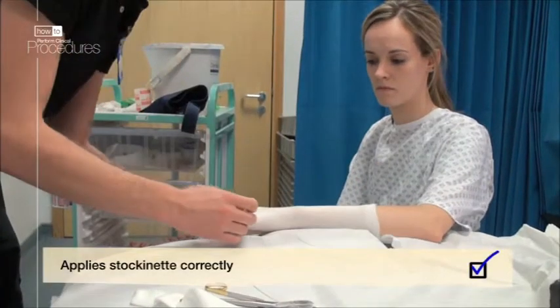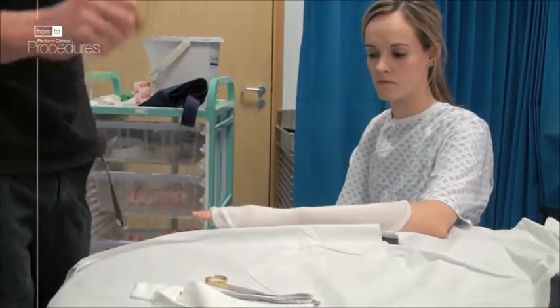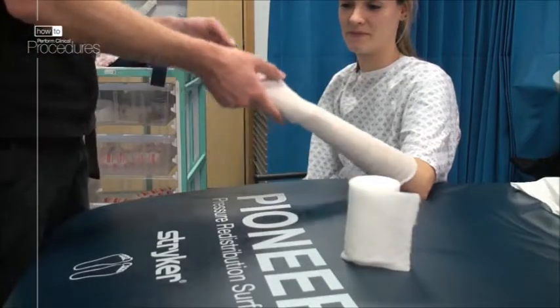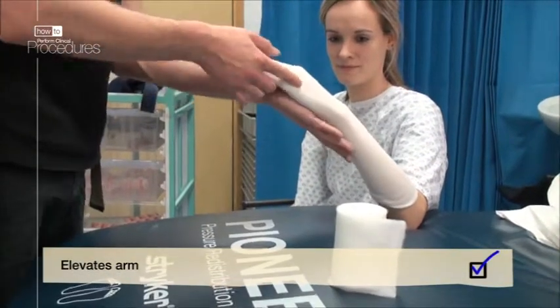Apply the stockinette all the way on and then bring it back distal towards the fingers. This method keeps movement to a minimum, which may be uncomfortable for your patient. Elevate the patient's arm, which may require an assistant if it's uncomfortable.